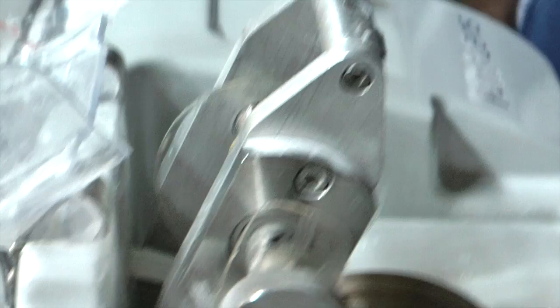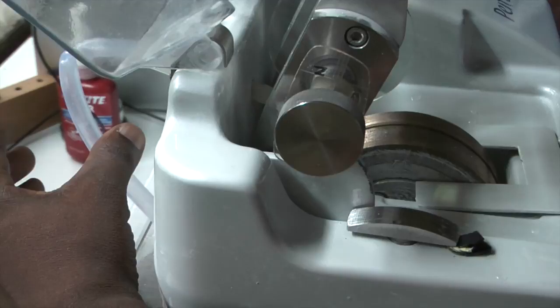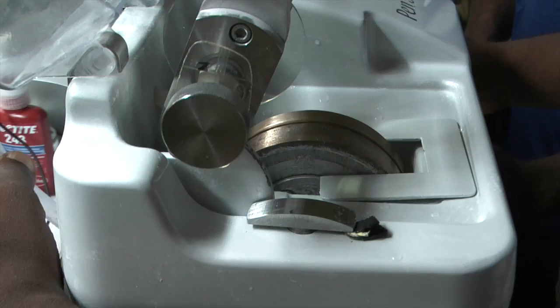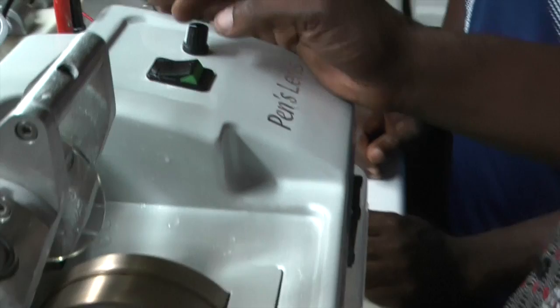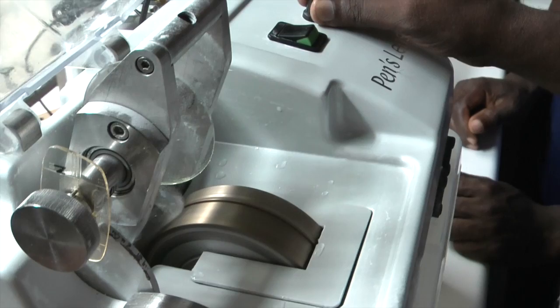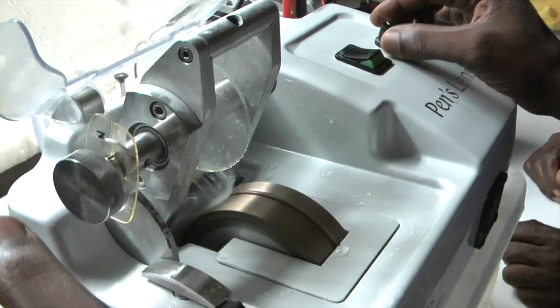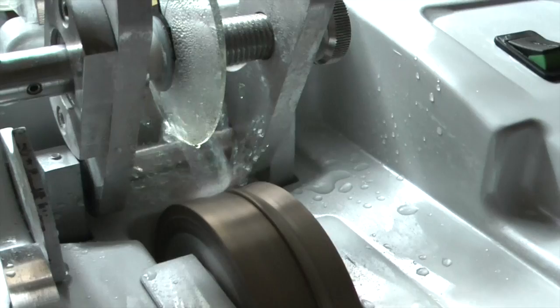We're now going to turn the machine on. With this machine we have to manually clamp the hose at the back - you don't have to do that when you first turn it on, you can leave it. Turn the machine on, then clamp it and use the water pressure. We have to clamp the pipe because if you don't you get a shower. You control the flow with your fingers and then reduce the amount of flow using that knob until you get the right amount of water, then we start to cut the lens.